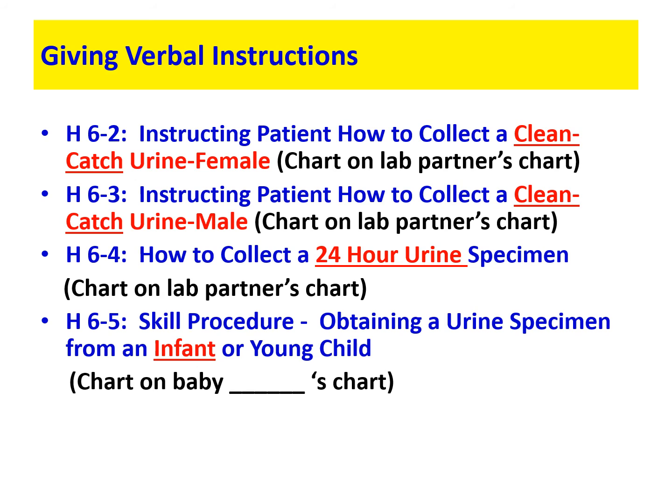If it has some type of preservative in it, we need to make sure we're familiar with that preservative and any caution we need to take with it, and we need to make our patient aware of it by looking at our material safety data sheets and knowing if there's any issues with that particular preservative. If we're not adding a preservative to it, we need to inform the patient that they need to keep that 24-hour urine container refrigerated.